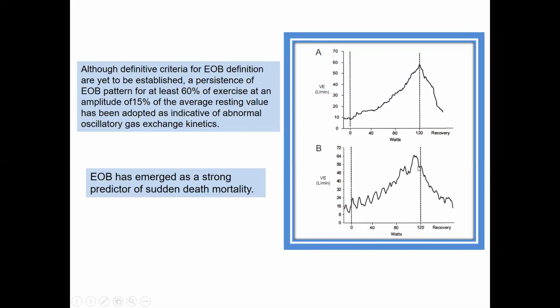If you see this, it's a very poor prognostic sign, and it's predominantly due to cardiac limitation, and it's a strong predictor of sudden cardiac death. So if you see this in a patient, regardless of what their other parameters are looking like, this patient has a high risk of sudden cardiac death. He needs close attention. All right.